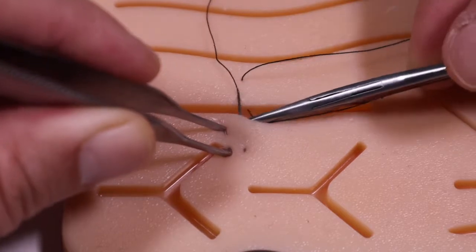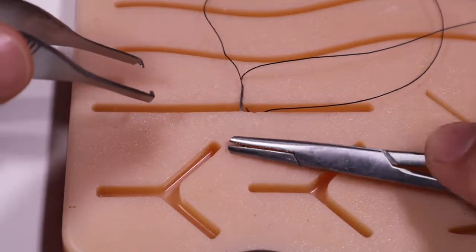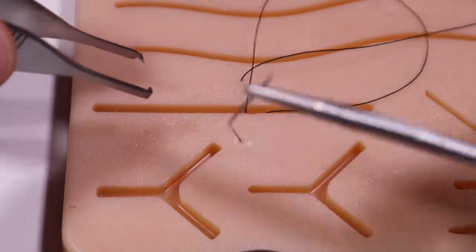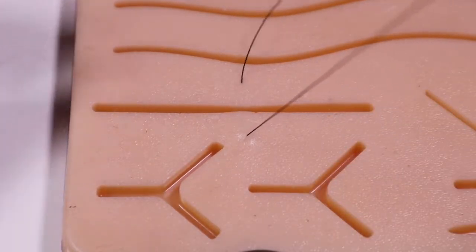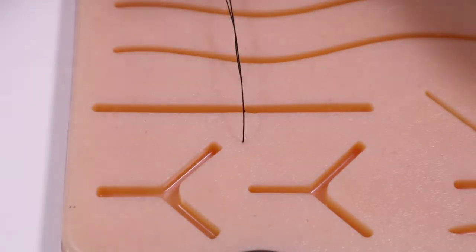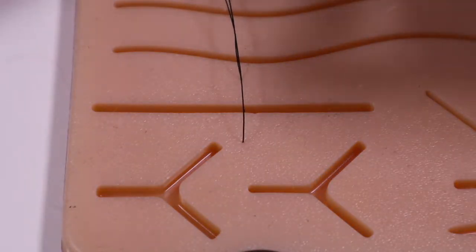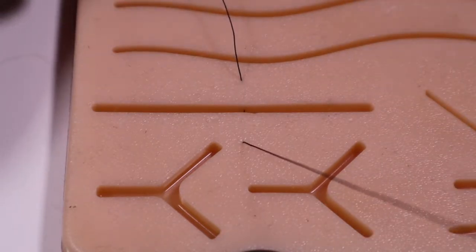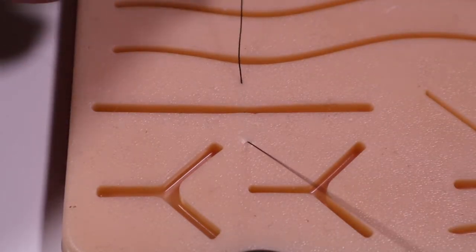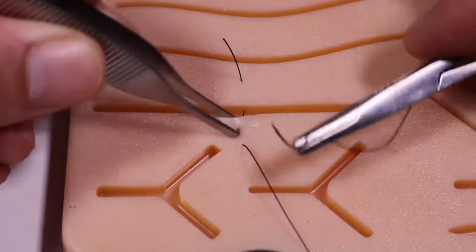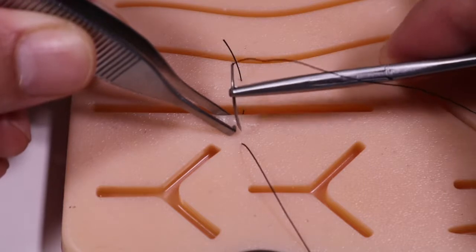Just as all the other suture techniques, we want to stay in the same plane as far as depth goes and come out about the same distance on the proximal side as we did on the far side. So we've got that passed through. We're going to reverse load our needle and backwards pass.